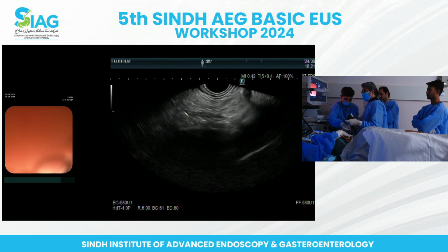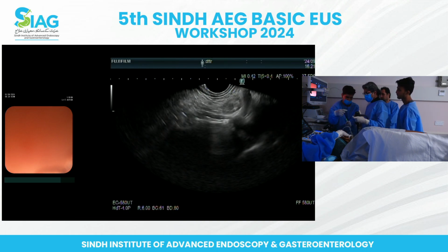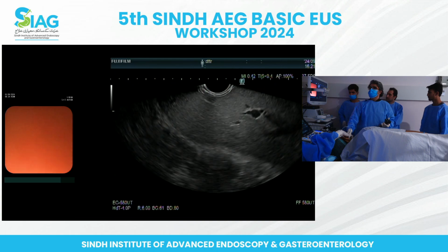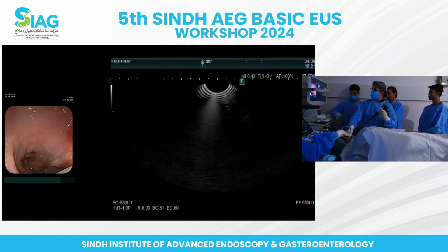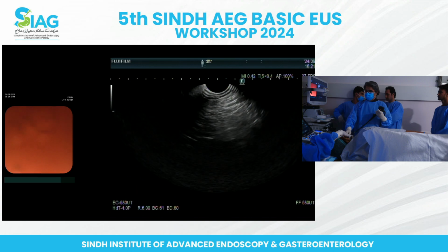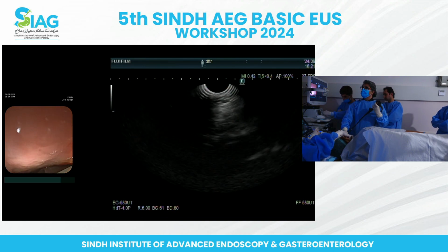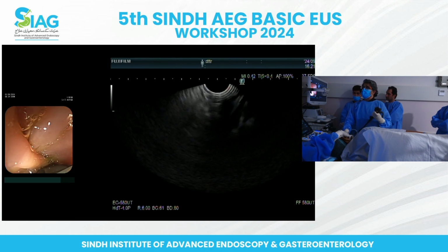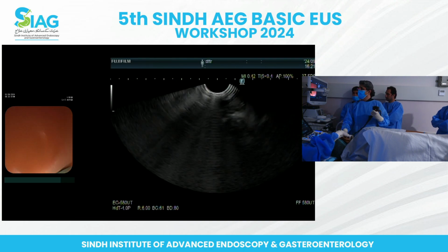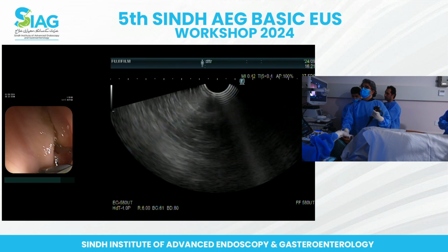I think I was clear of the vessel, but why don't we have a better look from another angle? I think you'll see it from D2, D3 because it's an uncinate type of region. Honestly I think you could get away with it from where you were, but why not avoid the vessel, of course. And I think that was the confluence that we were seeing there.